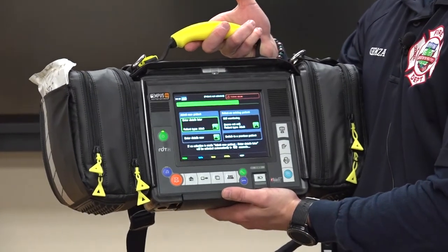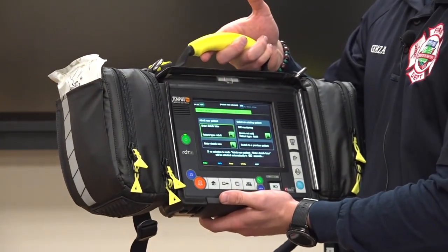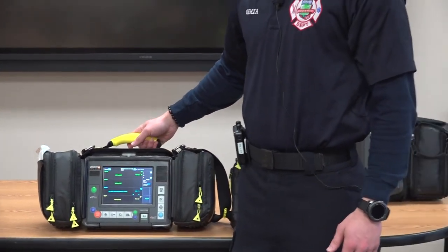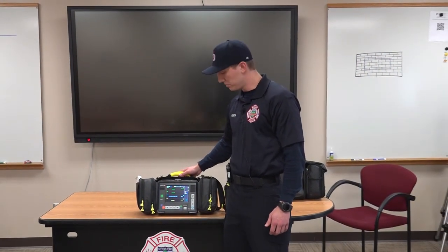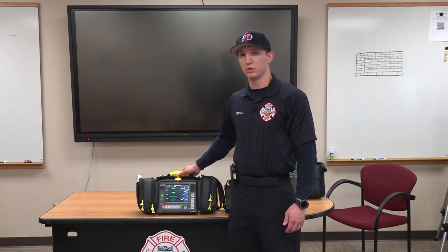We'll be using these on every single patient. You can add a new patient by typing in their name. These monitors have a program called Corsium. Corsium allows doctors in the hospital to see real-time patient data. So if I have a patient out in the field and I type in their information, the doctor in the hospital will be able to see that in real time.